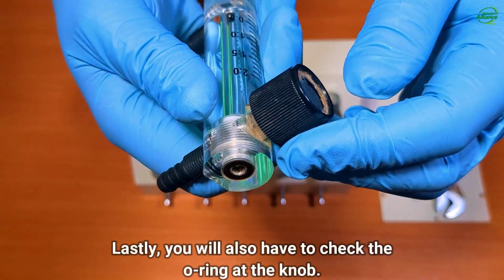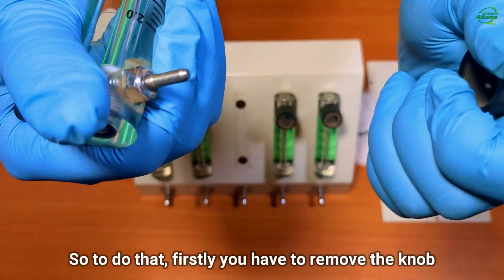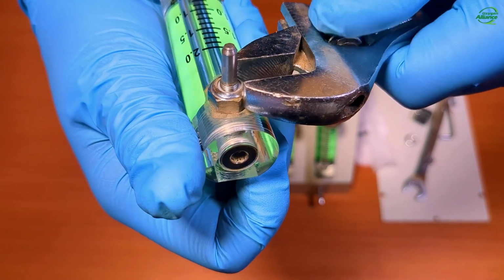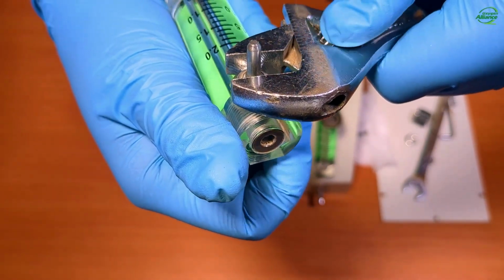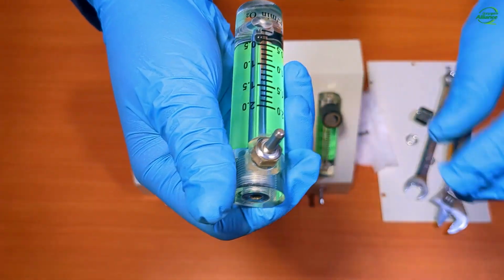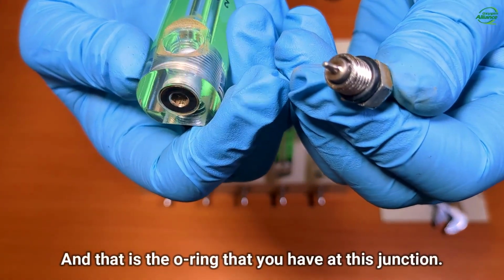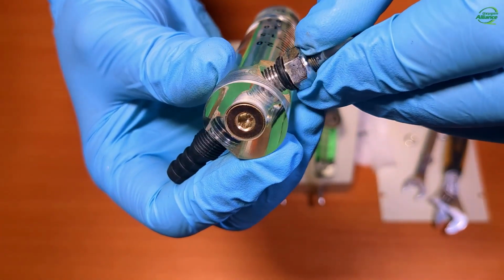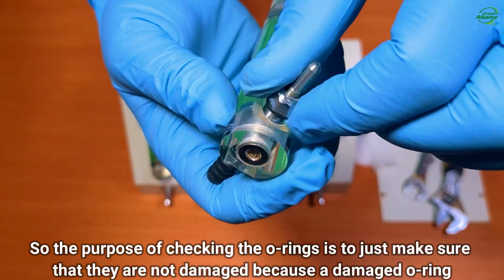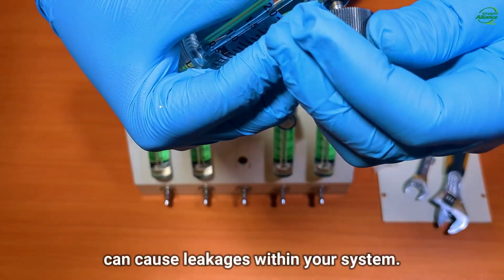Lastly, you also have to check the O-ring at the knob. So to do that, first you have to remove the knob. And that is the O-ring that you have at this junction. So the purpose of checking the O-rings is to just make sure that they are not damaged, because a damaged O-ring can cause leakages within your system.